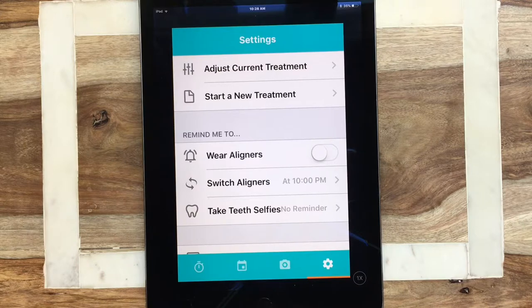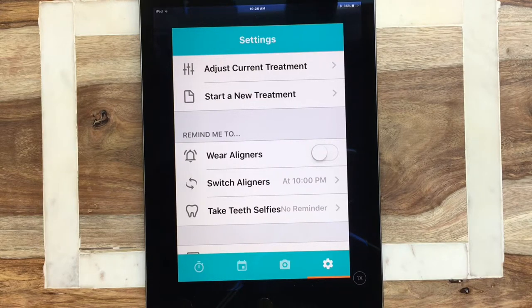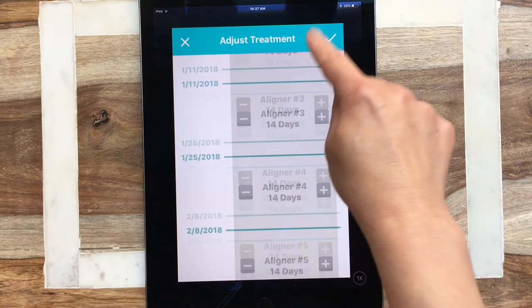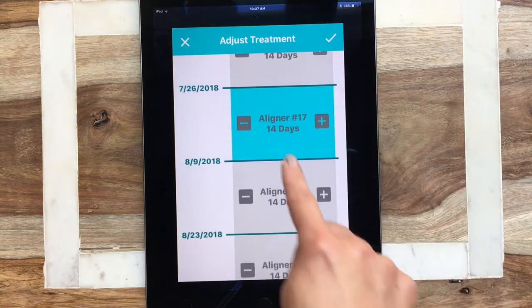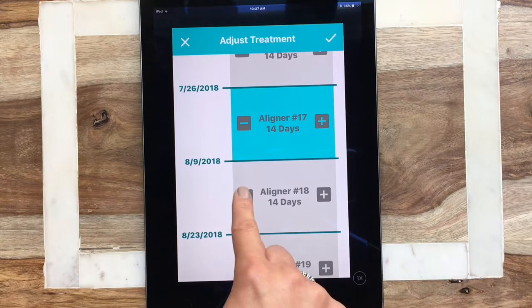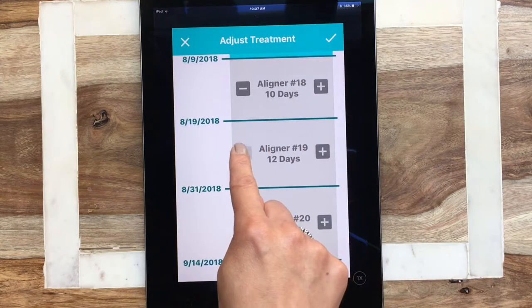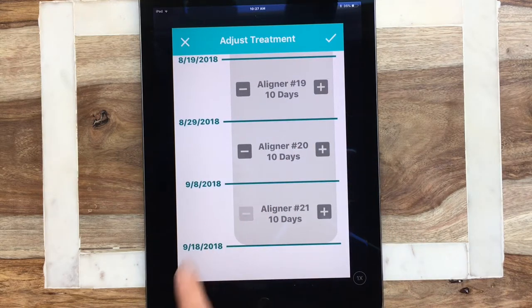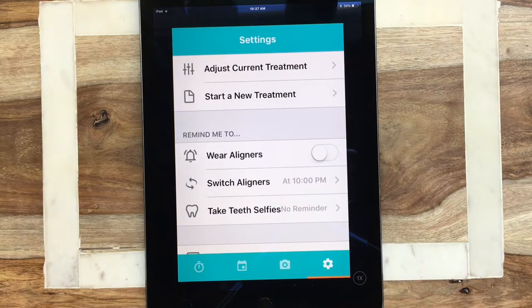Right now we're in the settings menu. If you ever need to adjust your current treatment — say for instance you are on 14 days and your orthodontist said 'great job, let's move you down to 10' — you'll go ahead and select 'adjust treatment.' We are on aligner 17 right now. Starting at aligner 18, let's say your orthodontist said 10 days, so you can bump it down to 10. You can do it manually or just start a new treatment. Click the check mark and there you have it.